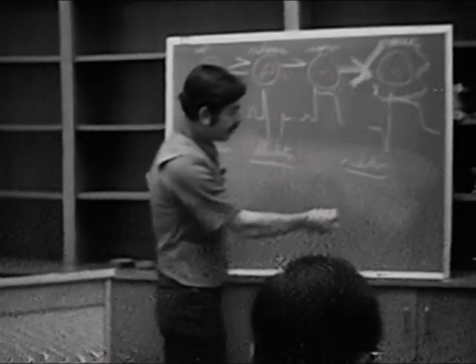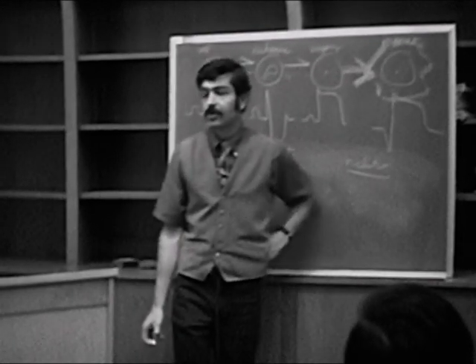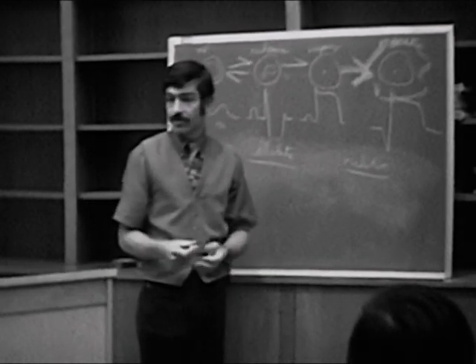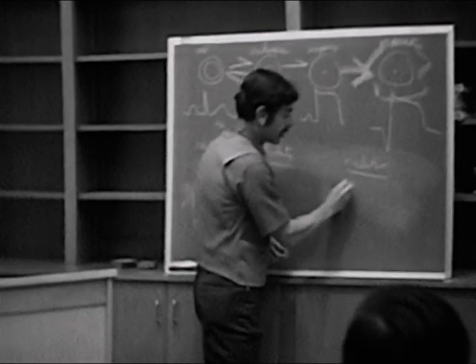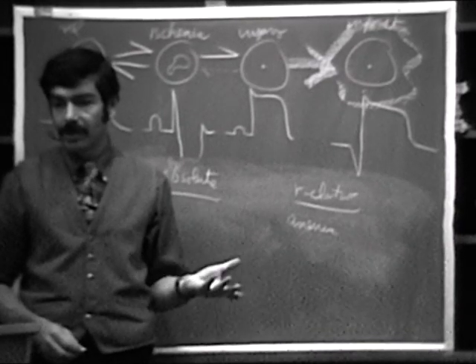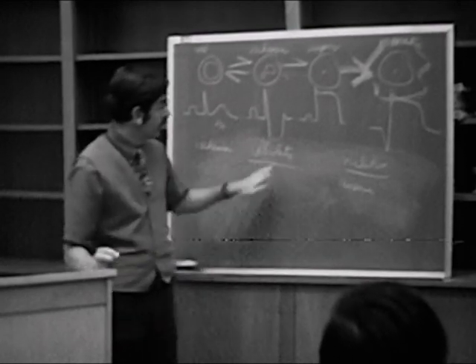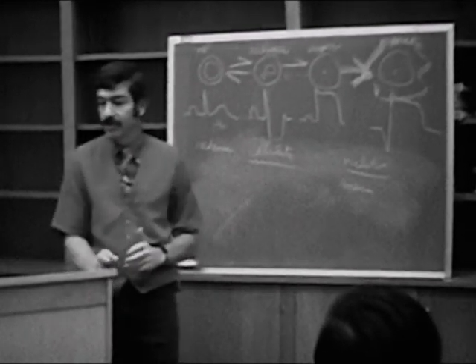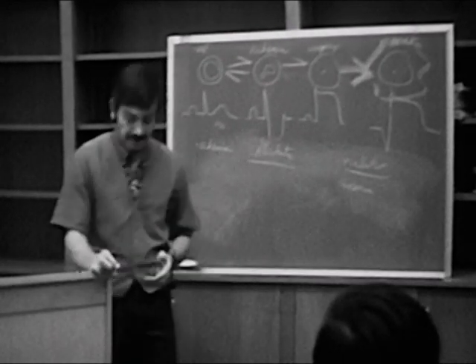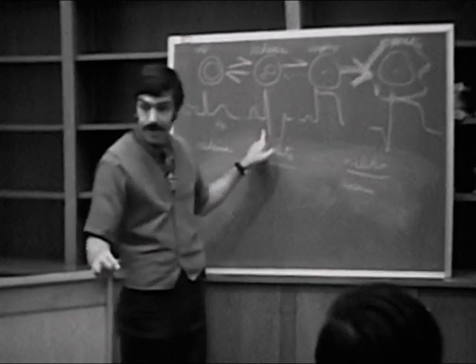So in certain states, for instance, you can think of quite a few of these where you have a large load upon the heart. What types of situations will produce a load on the heart? Anemia, for instance, right? Large volume load. And there's lots of things that will give you a volume load. Shunts, hyperthyroidism, hypoxia. Many situations that we clinically encounter will produce ischemia in the electrocardiogram, as well as pressure overloads. The heart is really susceptible to pressure overloads. And things like aortic stenosis, hypertension will very readily wind up producing the ischemic pattern on the electrocardiogram.